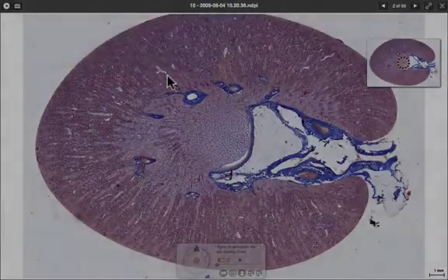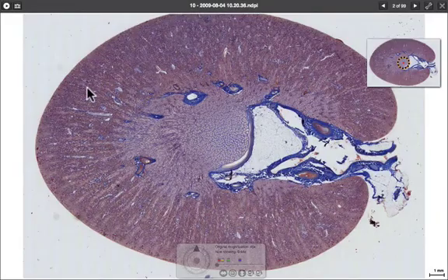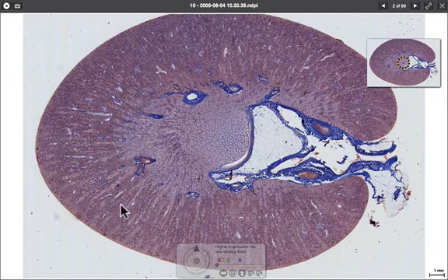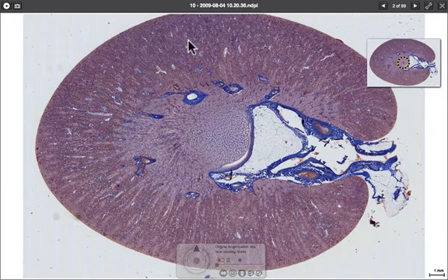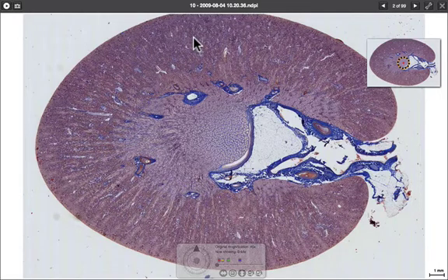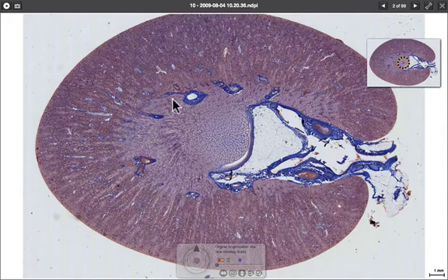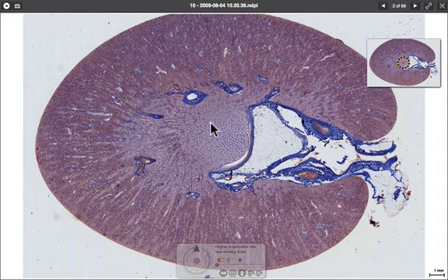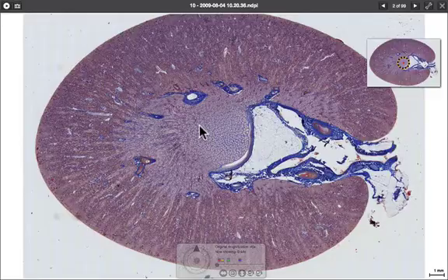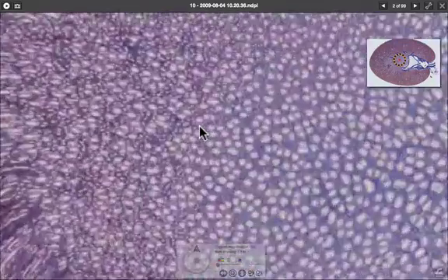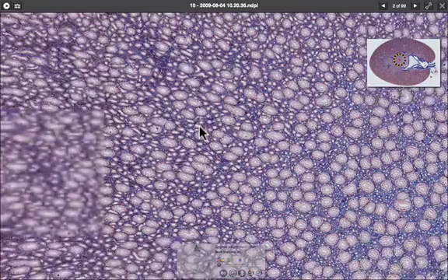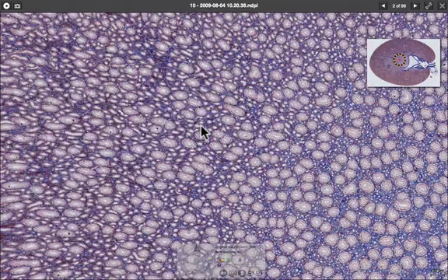So that was the cortex, which is mostly filled with glomeruli and proximal and distal convoluted tubules. The medulla, on the other hand, is mostly the loops of Henle and collecting ducts. Let's have a closer look in there.